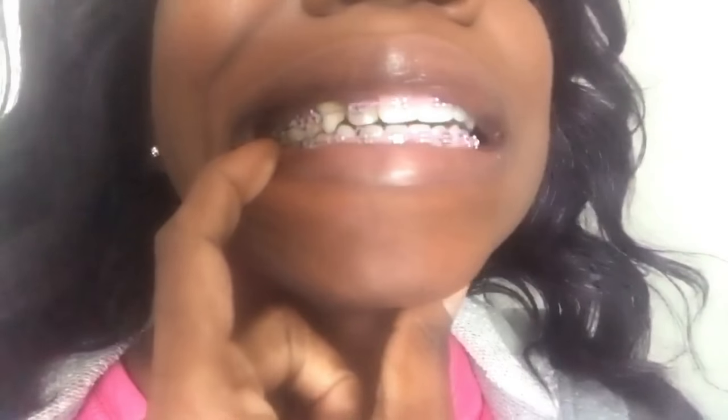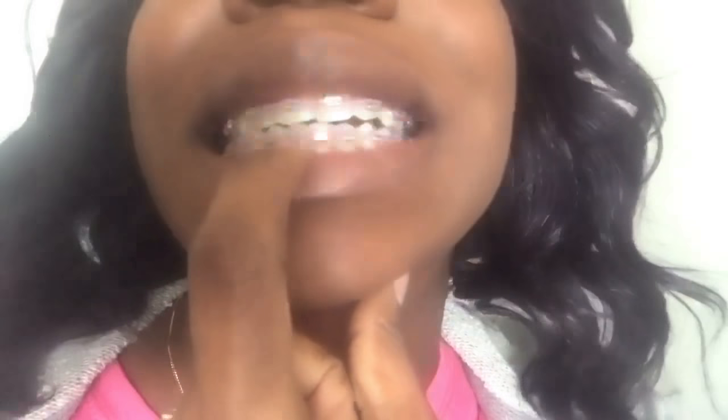Okay guys, so I just got done from the orthodontist visit. It probably took like less than 15 minutes — probably like 10 minutes or less — and then I went to make my payments. But this is how we're looking. I got some power chains right here, power chains over here, and a big one on the bottom right here.